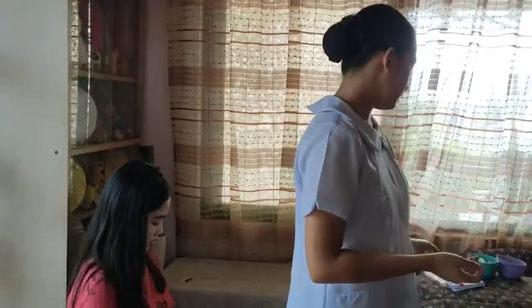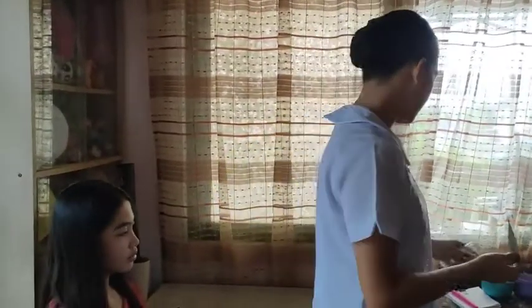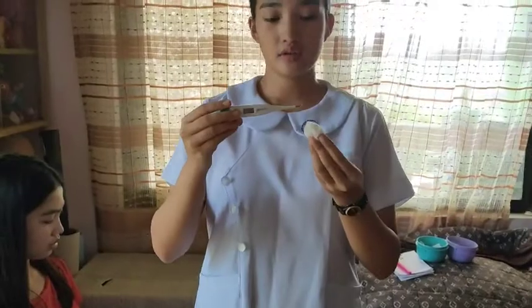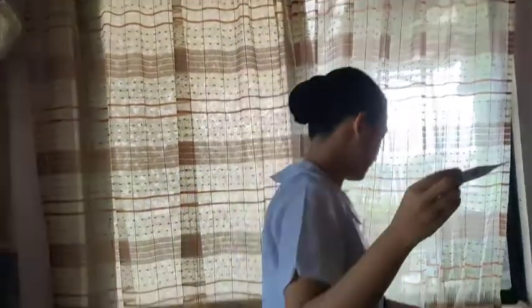The first thing we need to do is take out the thermometer from its pack, then wipe the tip — from the tip that will come in contact with the client to the area where you hold it. This helps sanitize the thermometer to avoid contamination of germs and to have a more accurate reading of the temperature.